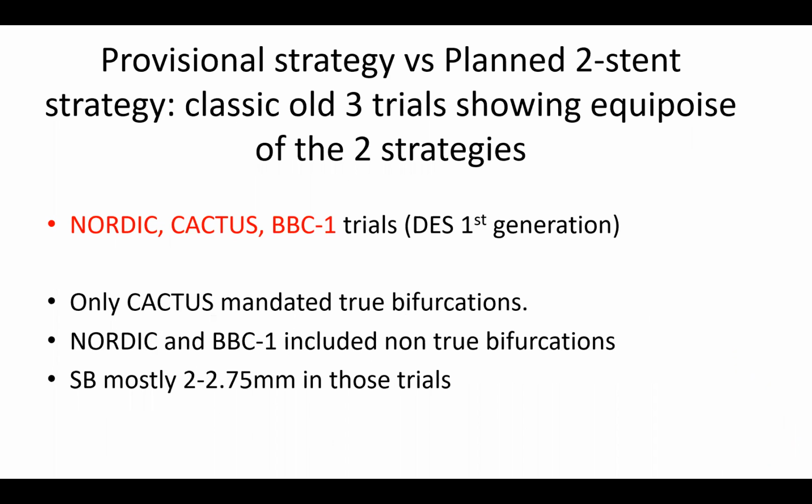Now I want to talk about the data that studied the two main strategies of provisional versus planned two-stent strategy. You need to know the three classic trials that were done in the early to mid 2000s, Nordic 1, Cactus, and BBC 1 trials.